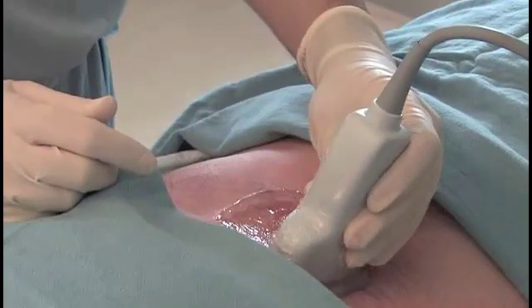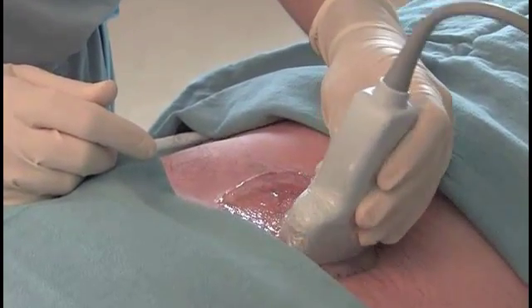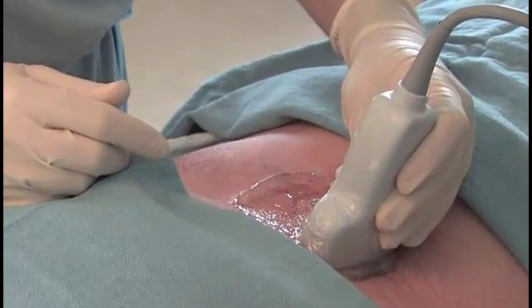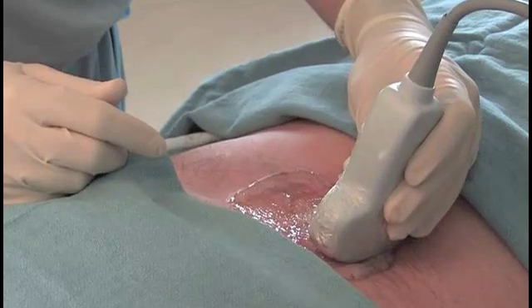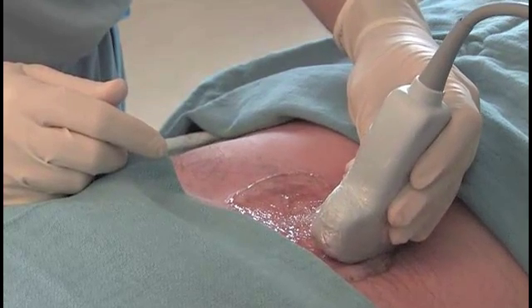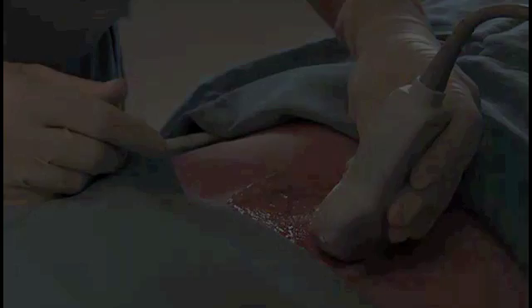Ultrasound guidance enables direct visualization of the lumbar facet as well as the needle position in relation to the joint. Severe obesity and grossly distorted spinal anatomy are contraindications to the procedure.